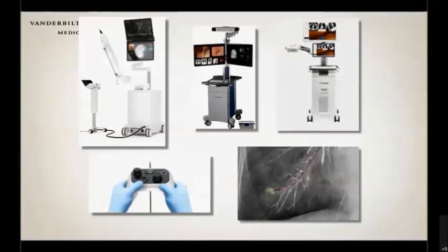So there's a lot of new technologies that have been proposed in the past 5-10 years that have essentially looked at how to improve the navigation to the nodule. There's shape sensing technology, virtual bronchoscopy, electromagnetic navigation, algorithms that try to determine where exactly we stand in the airway, and radial ultrasound, and so on.